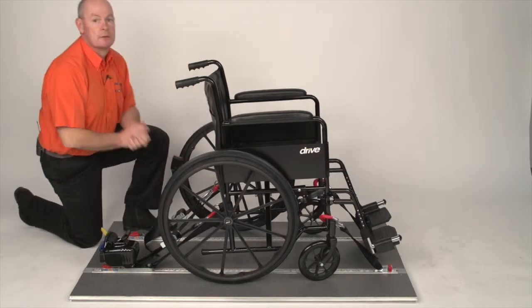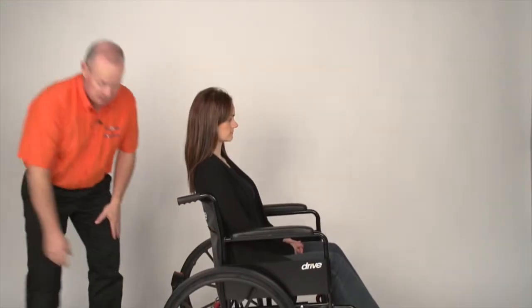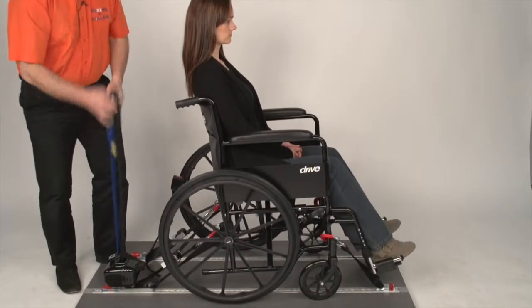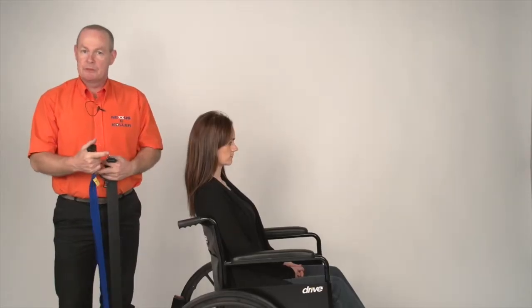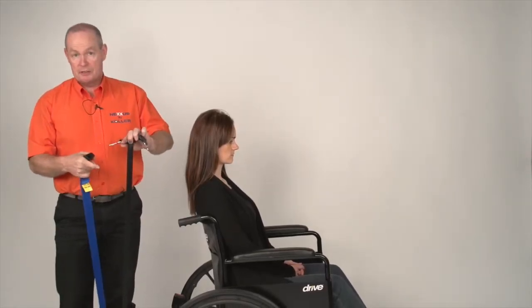The wheelchair is now secured. I am going to put the passenger harness on. All of our reels are colour coded — black and blue for ease of use. The black is the lap belt and the blue is the diagonal. They are all split into two.